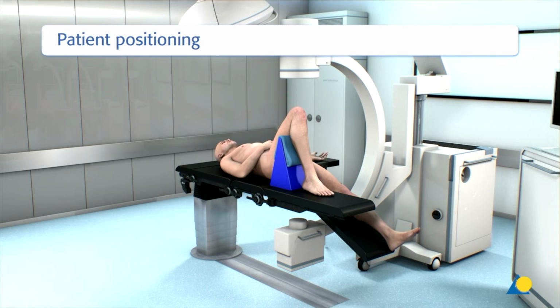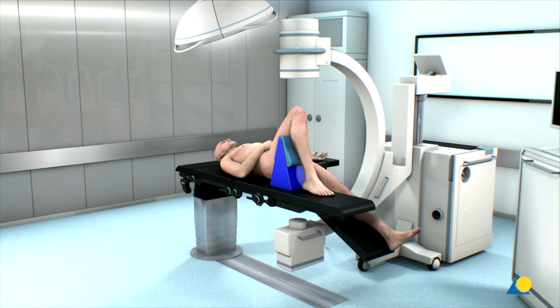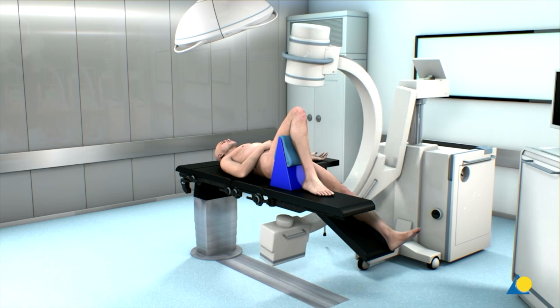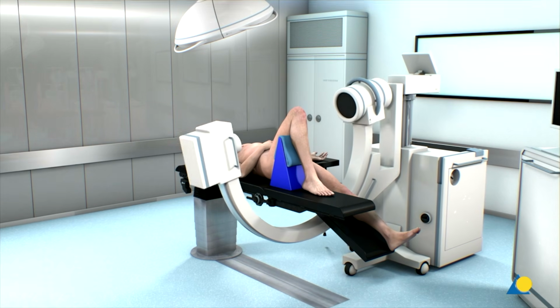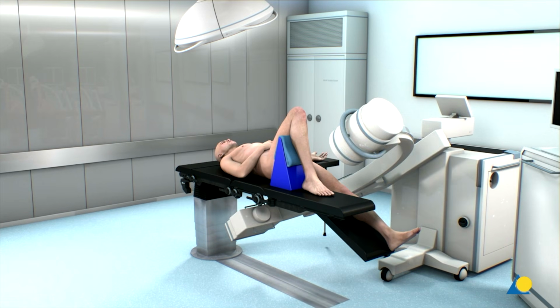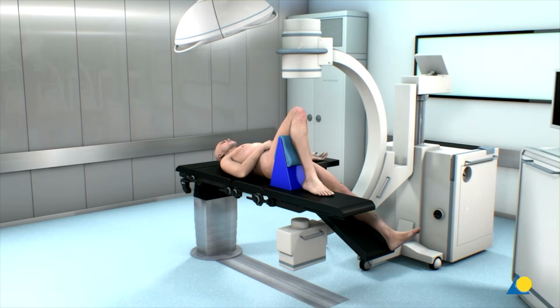The patient is positioned supine on a radiolucent table with the knee flexed from at least 90 and up to 110 degrees. The image intensifier is positioned so that visualization of the tibia, including the articular surface proximally and distally, is possible in both the AP and lateral views.